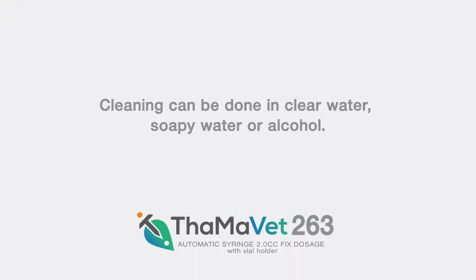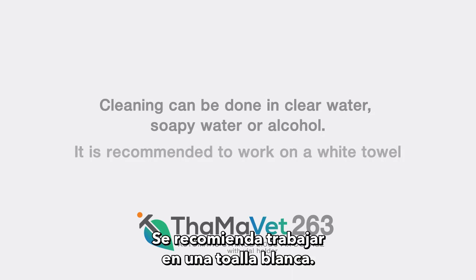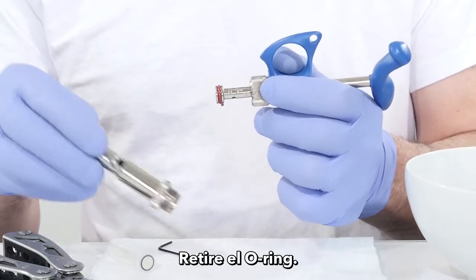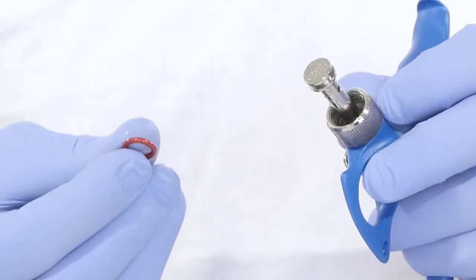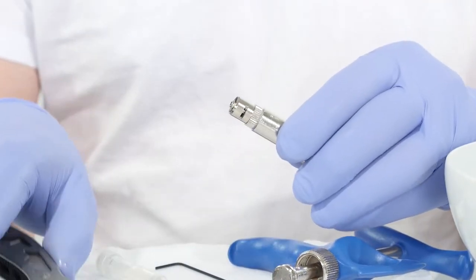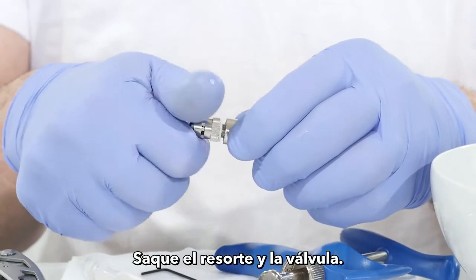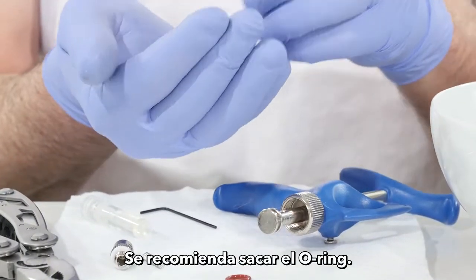End of day cleaning: cleaning can be done in clear water, soapy water, or with alcohol. It is recommended to work on a white towel. Open the syringe body, remove the o-ring, then using pliers, open the lure lock.